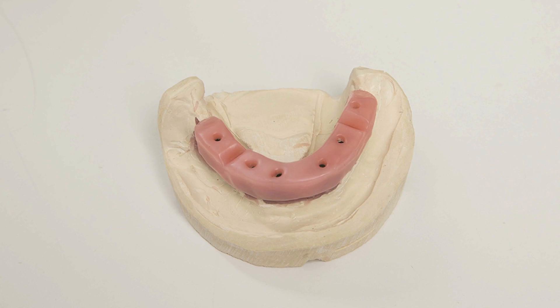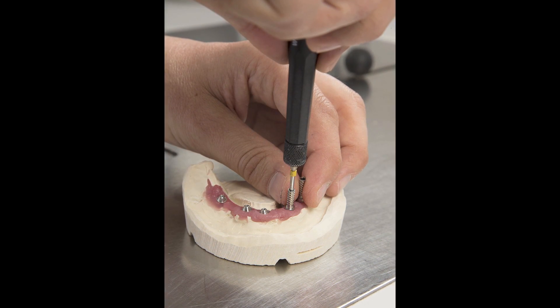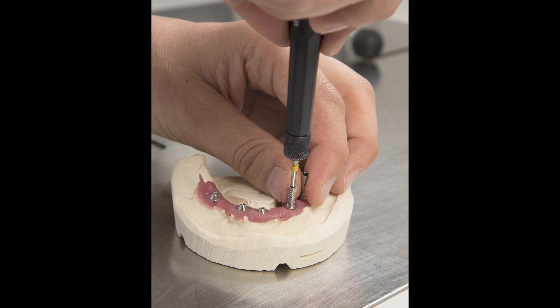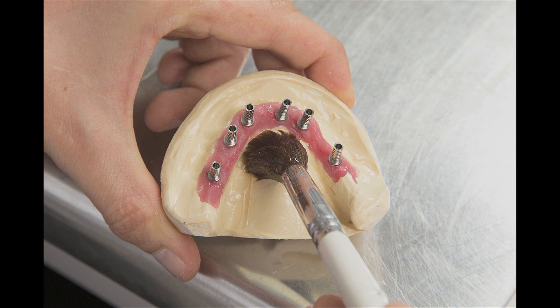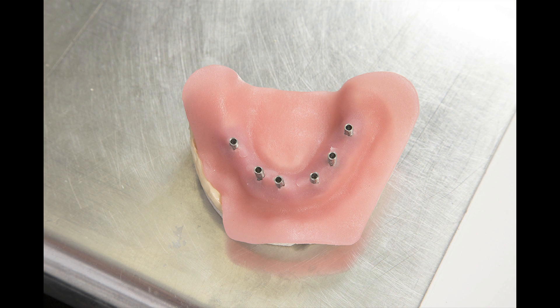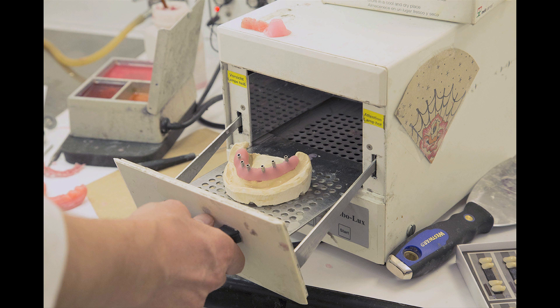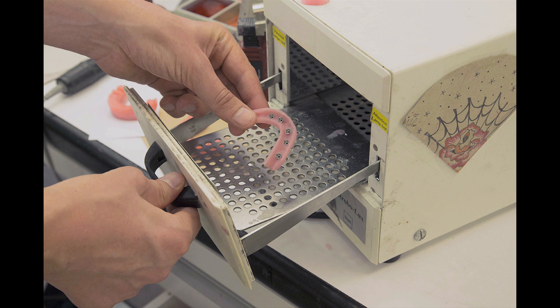Next, the bite block is fabricated. Non-engaging titanium cylinders housing prosthetic screws are attached to each implant analog in the working model to ensure that there is no movement when the bite block is fabricated, as well as when the jaw relations are recorded by the doctor. Separator is applied to the model to prevent wax from adhering. Lycure base plate material is molded over and around the cylinders and pressed down over the working model, ensuring that no material obstructs the cylinder holes. The base plate is then trimmed along the facial and lingual walls that overlap the alveolar ridge. After light curing the base plate on the working model, the titanium cylinders are unscrewed and the base plate is removed from the model and inverted to complete the curing process.